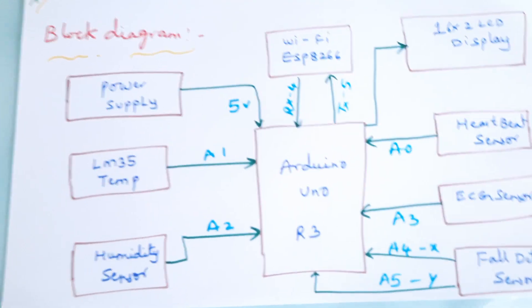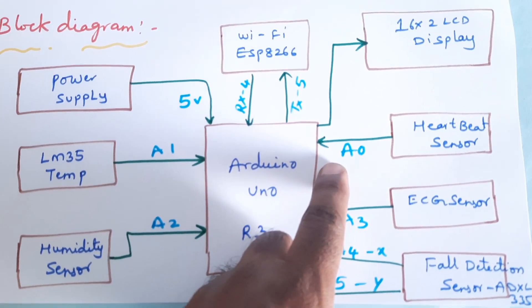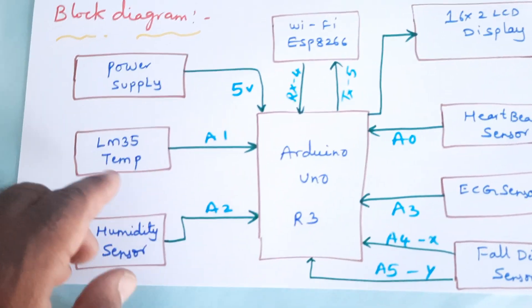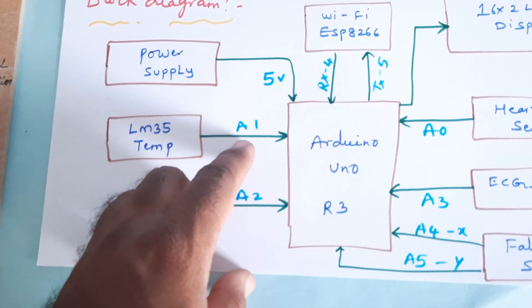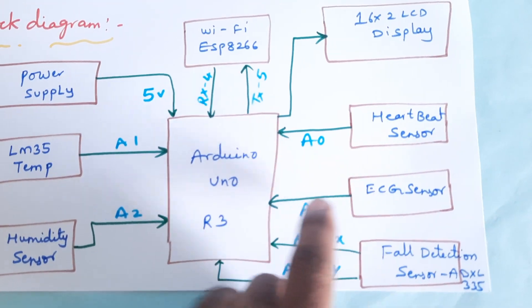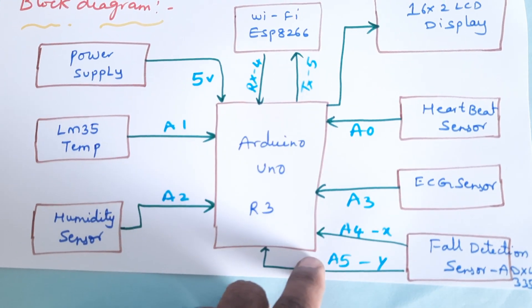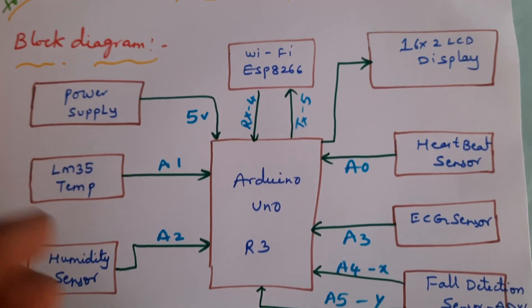In this project we are using an Arduino Uno R3 board. The heartbeat sensor is connected to analog pin A0, the LM35 temperature sensor to A1, the humidity sensor to A2, the ECG sensor to A3, and the fall detection sensor to A4 and A5.